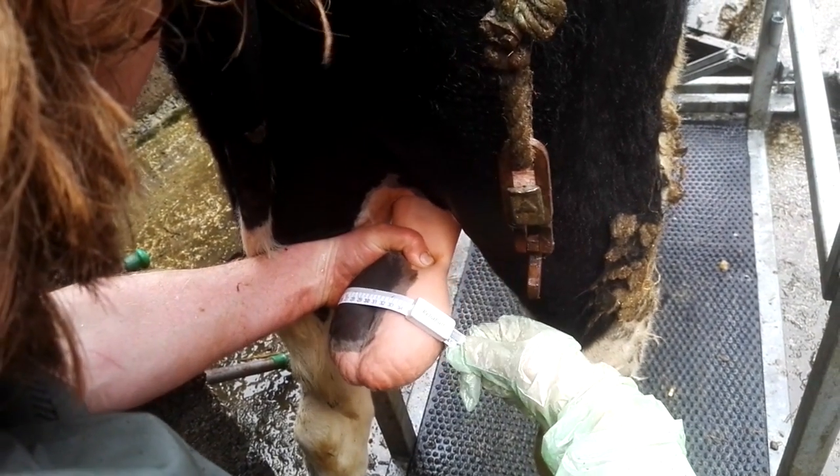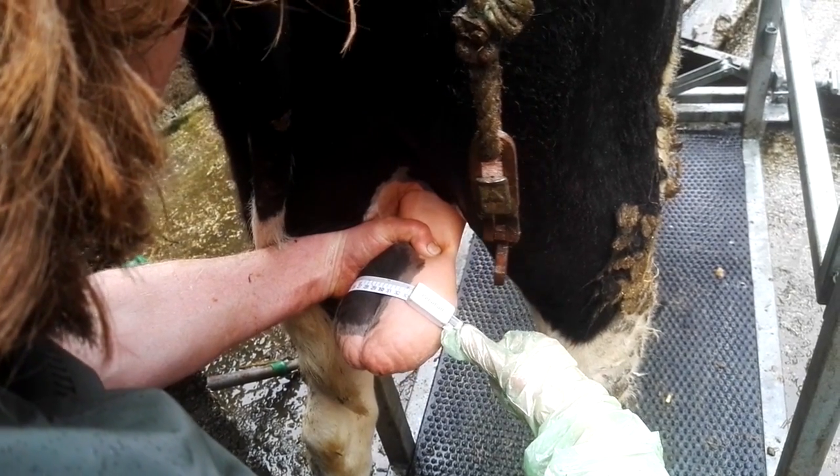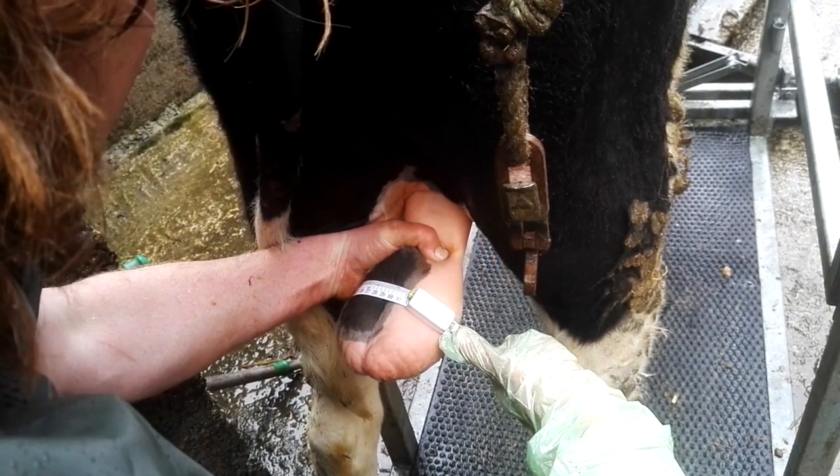Just coming in at 34, 33 and a half centimetres. I'm going to push it too far — gone to 32, I'm in the red, I've gone way too far. The green is coming in at just 33. That's right.